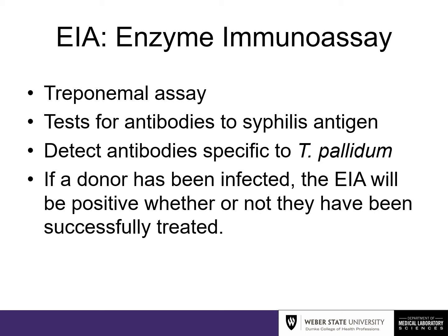And this one, like it stated previously, detects antibodies specific to the T. pallidum, which is the spirochete that causes syphilis. And if a donor has been infected, the EIA will be positive whether or not they have been successfully treated.